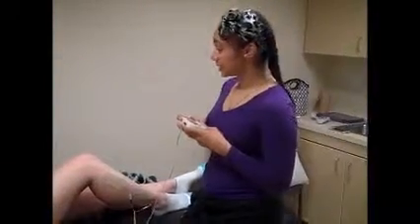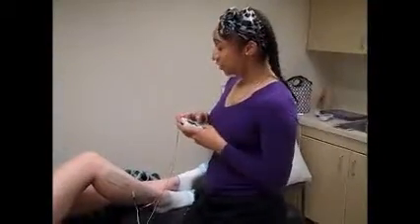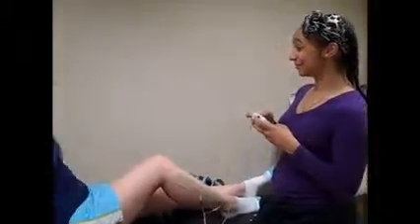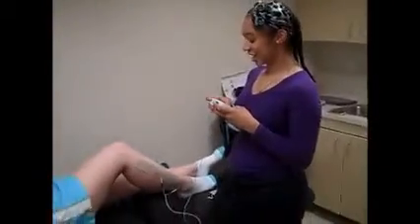So Sarah, you're going to start to feel a tingling sensation, then it's going to start to feel like a massage. Let me know when it's strong but comfortable. So we're going to go ahead and adjust this. Alright, that feels good.